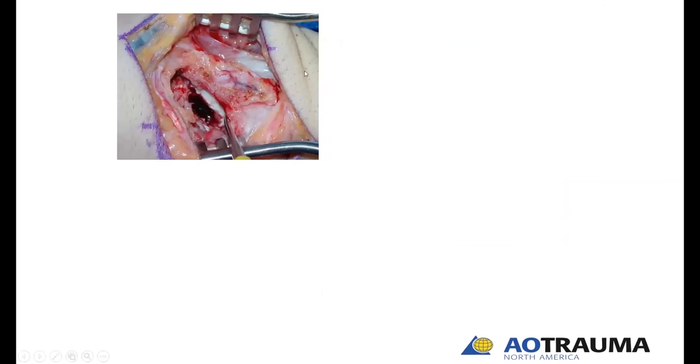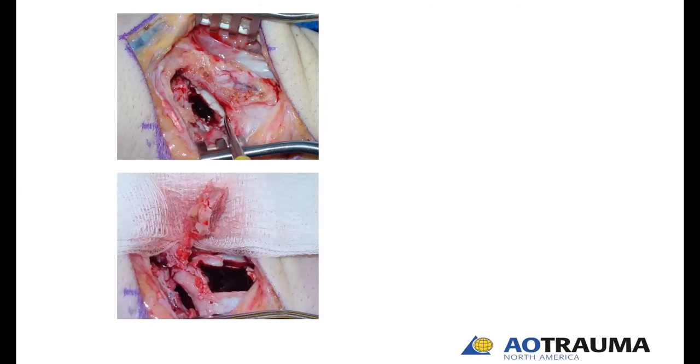This is preparation of the graft and the scaphoid defect. You can make out the proximal fracture line — the freer elevator is bringing that up. I've created a longitudinal trough within the body of the scaphoid that will bridge that fracture and evacuated most of the dysvascular bone from the proximal fragment, leaving the cortical shell. The vessels are here directly over the retinaculum. Incisions have been made in the first and second compartments and the tendons retracted, leaving the soft tissue cuff.